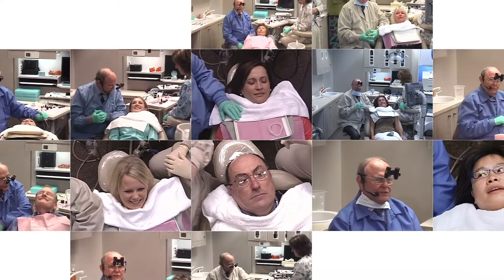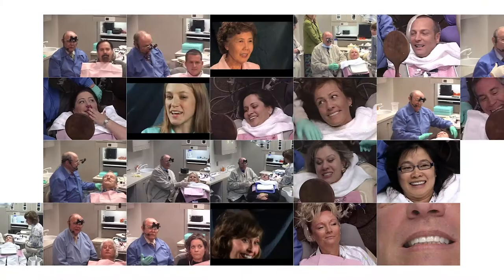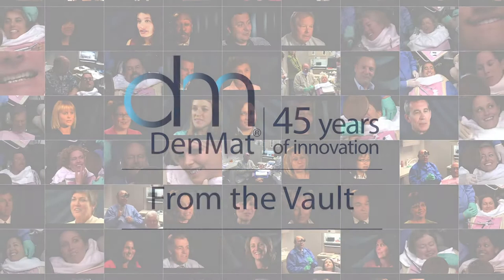Now we're going to place 10 lumineers today on our patient. And now we're not treating teeth anymore — we're treating smiles. Isn't that beautiful? Let's look at the transformation from where we started and where we are.